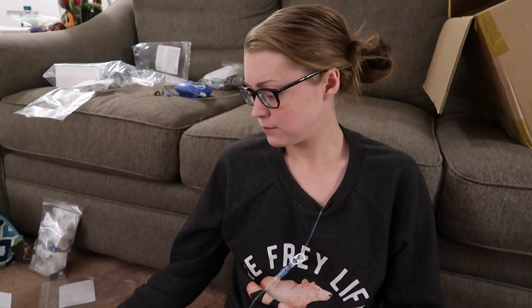Our first time, so don't take tips from this video. Dexcom, if you're new to this, is a continuous glucose monitor. So instead of Mary pricking her finger all the time to check her blood sugar, this does it continually and has a little screen that tells her what her blood sugar is.